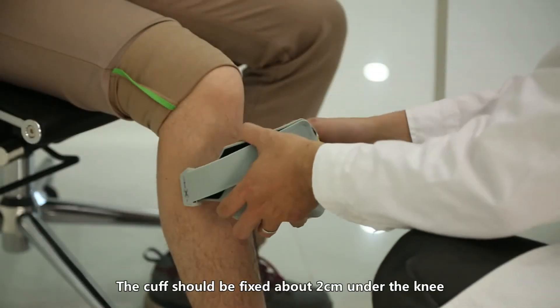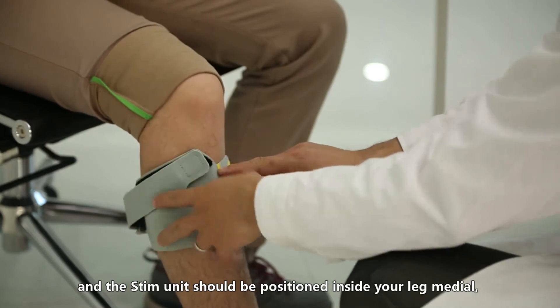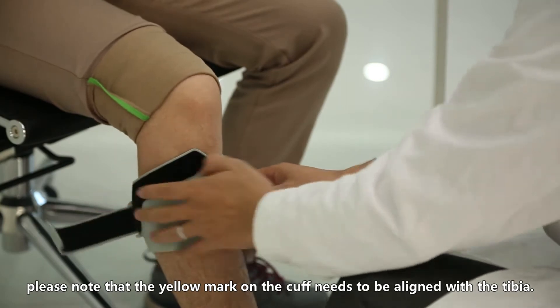The cuff should be fixed about two centimeters under the knee, and the stim unit should be positioned inside your leg, medial. Please note that the yellow mark on the cuff needs to be aligned with the tibia.